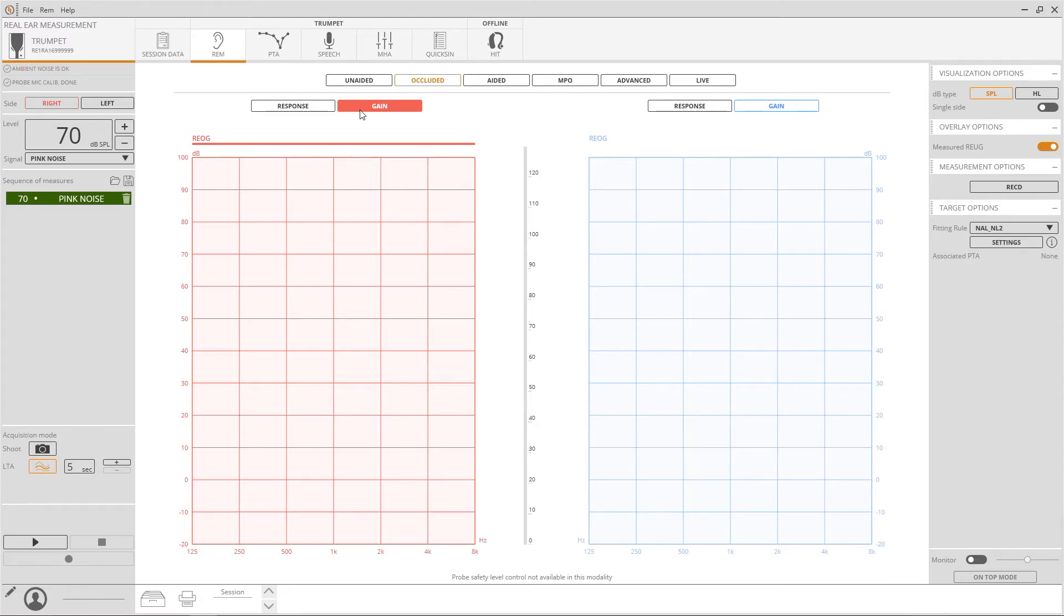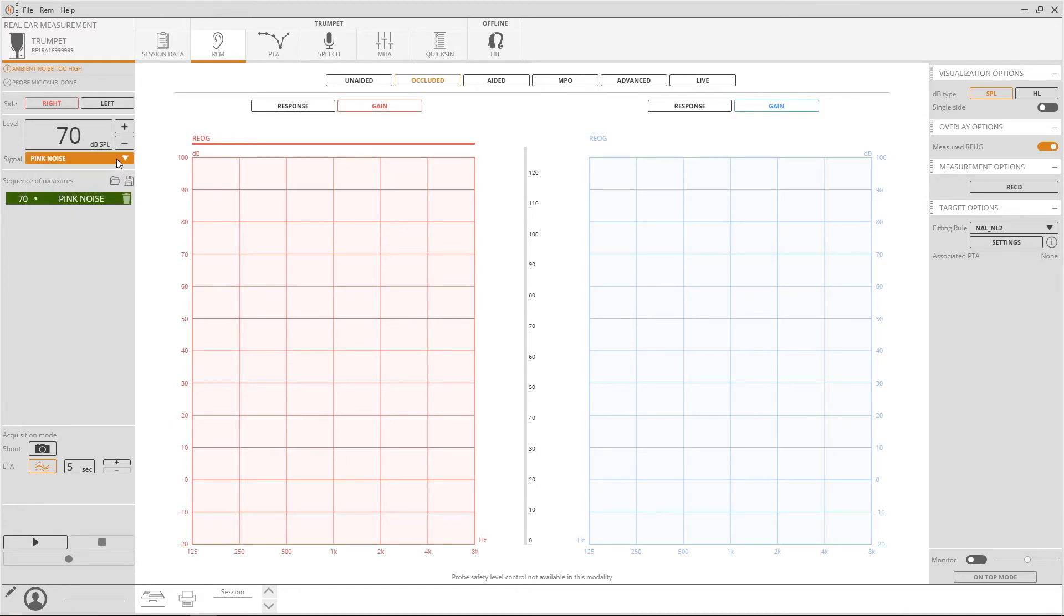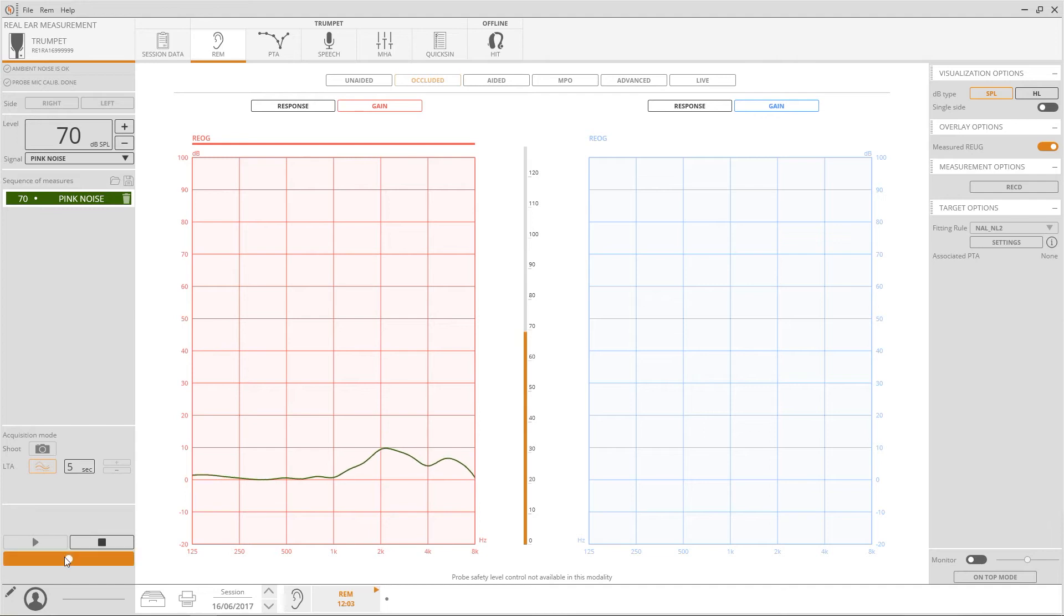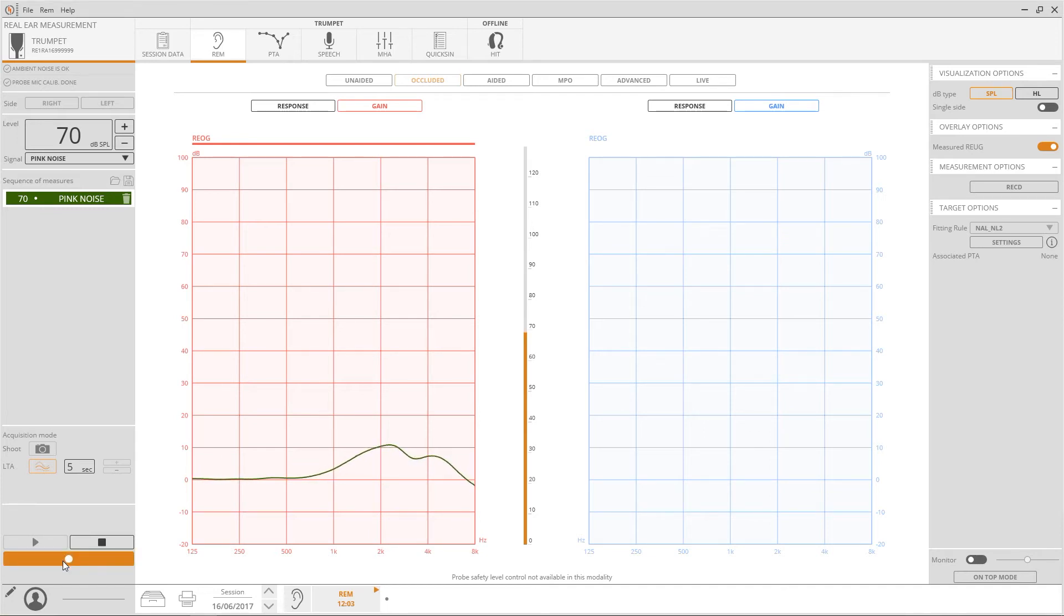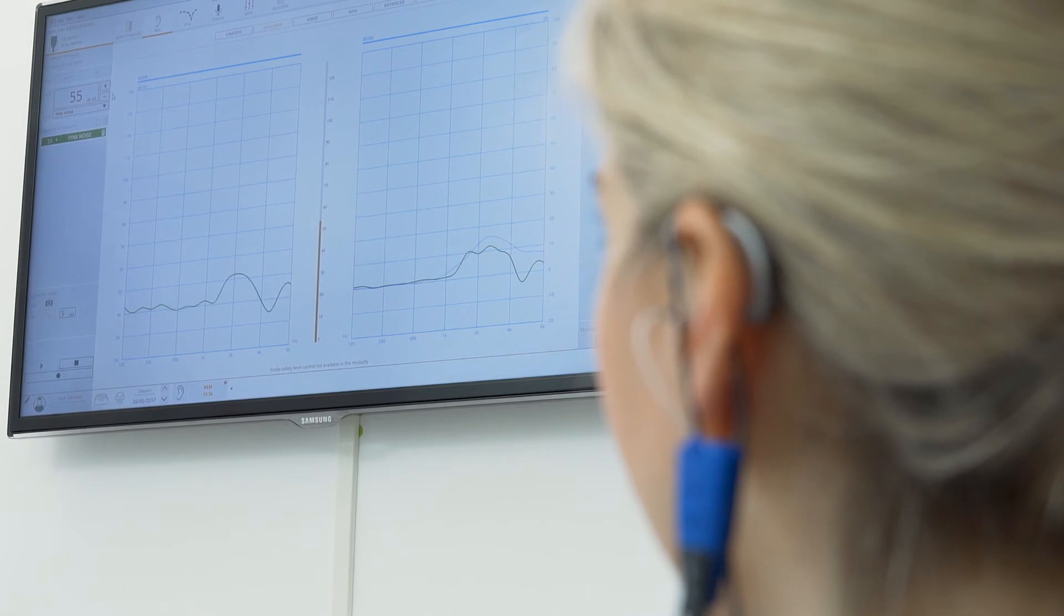In the upper left panel, a drop-down list allows to select the stimulus to send as input to the loudspeaker. By pressing the play button, the acquired curve will be displayed on the graph but not recorded so that the probe can be adjusted until the positioning achieved is correct. When you trust that the acquired curve is okay, it can be easily recorded by pressing the record button. The values will be kept in the software and displayed on the graph.